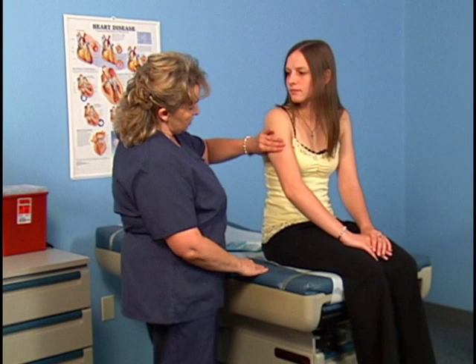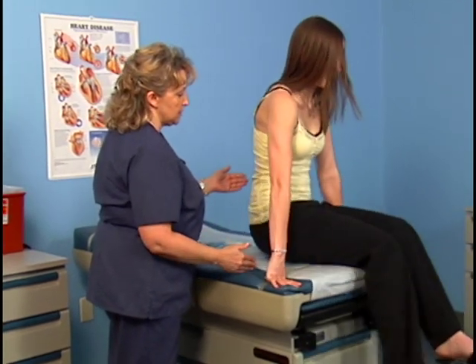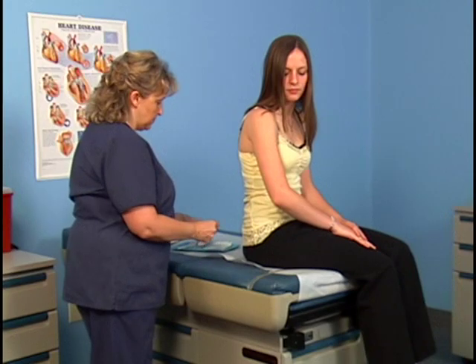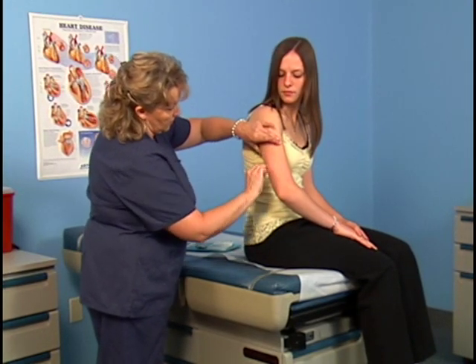Carmen's last allergy injection was administered into her left upper arm, so this injection must be administered into her right upper arm. Make sure the entire area is well exposed to ensure a safe and comfortable injection. Cleanse the site with an antiseptic wipe using a circular motion. Start at the injection site and move outward.